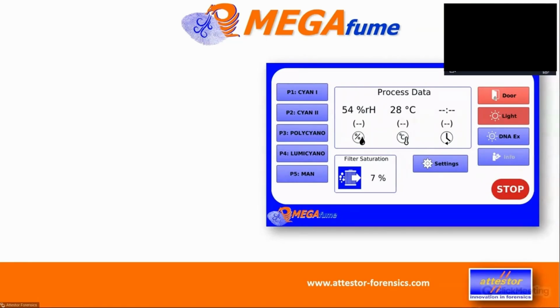Then the most important button on the screen is the stop button. At any time, you can press the stop button and say stop where we are at the moment. The system will obviously ask you whether you are sure to stop it now, because you might actually just have touched it by accident. But when you confirm, yes, I am sure, it stops the process.